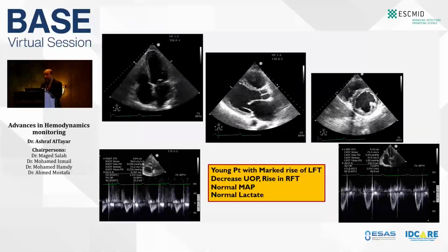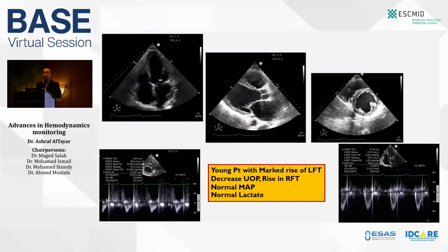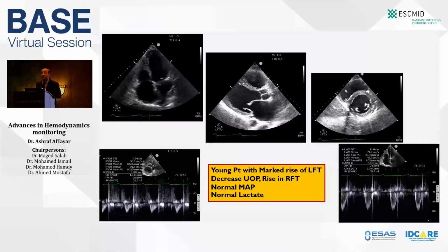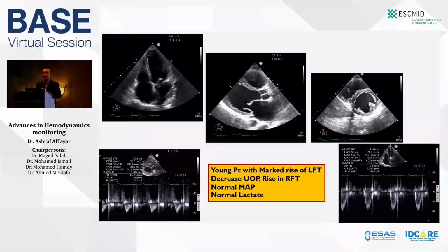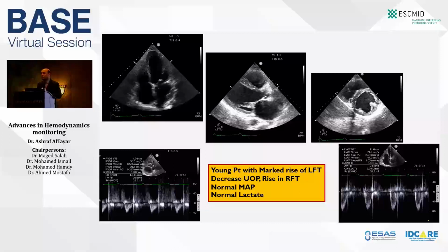Adapt your eye to identify if the heart is behaving like what you see in front of your eyes now, which is known as cardiogenic shock, because the heart doesn't pump much blood out. And then what you need here is to fit it into the context of the clinical presentation, and you choose to go with inotropes.